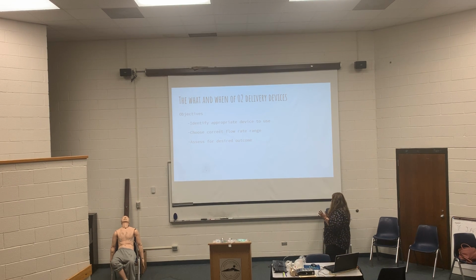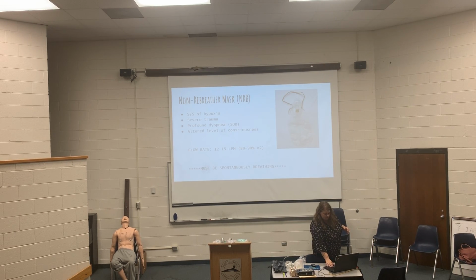So what we're gonna go over, like I said, is we're gonna identify the appropriate device to use, choose the correct flow rates for it, and assess for desired outcomes, and then we can talk about what to do if it's not the outcome that you're wanting.